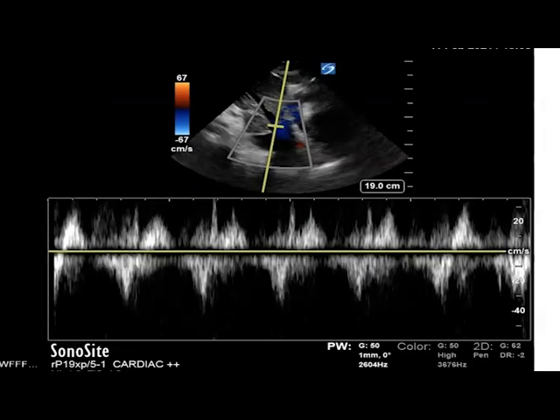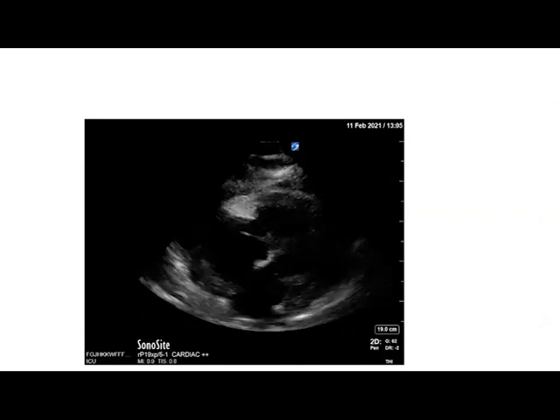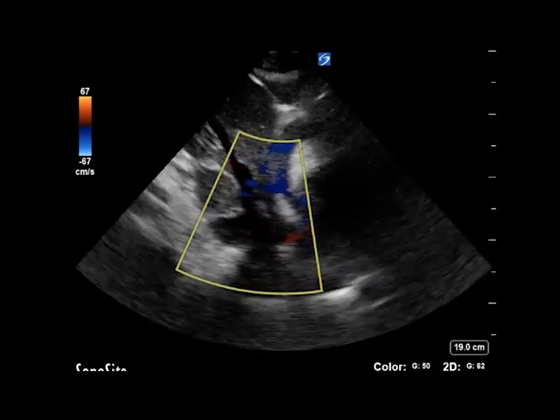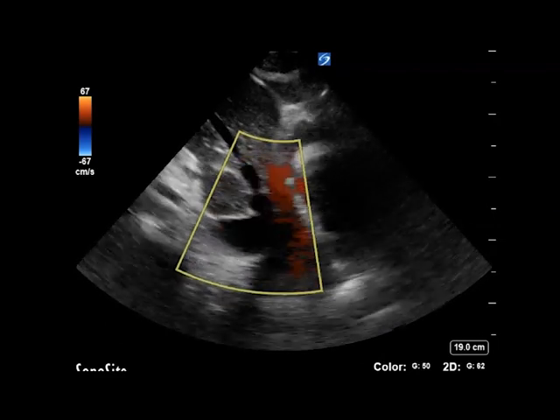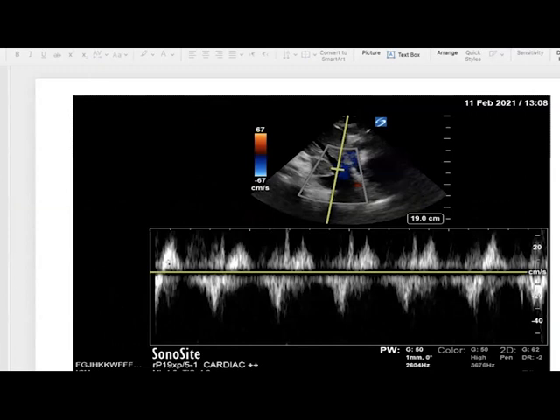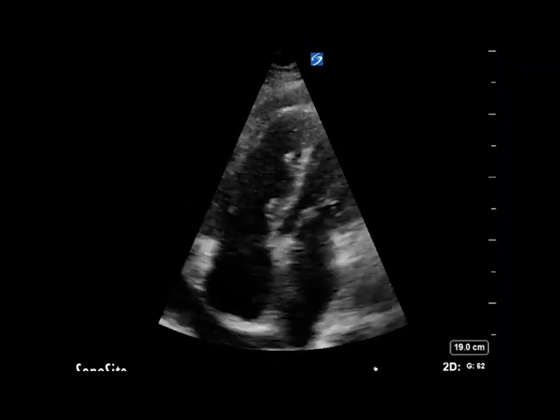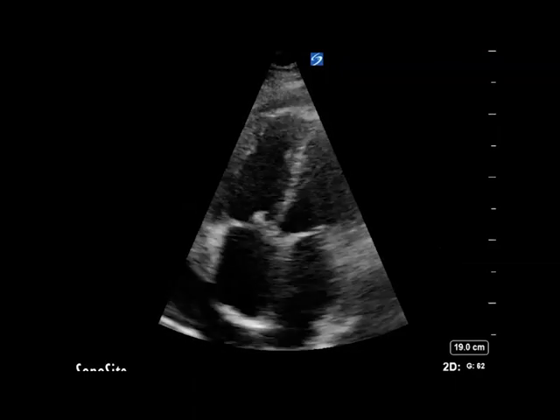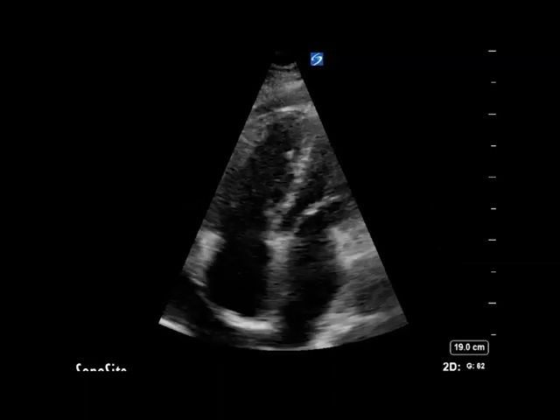There's reversal of hepatic venous flow — not a perfect angle but a quick point-of-care assessment. The red signal coming back in the hepatic vein every now and again — that systolic reversal — should prompt you to do pulse wave Doppler, as it suggests TR severity. Overall this is a nice case demonstrating all the signs of pulmonary hypertension — the RV is not showing severe dysfunction, maybe mildly impaired, but there's a constellation of findings including RV dilatation and heavy trabeculation suggesting a chronic process, along with a thickened RV free wall.